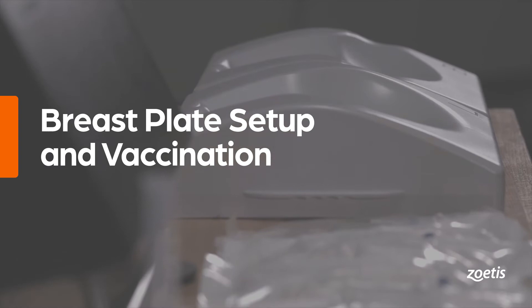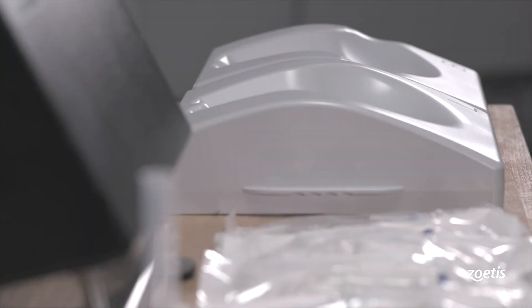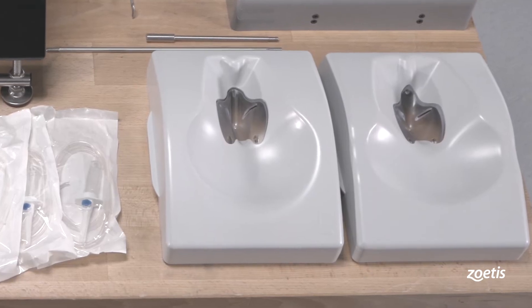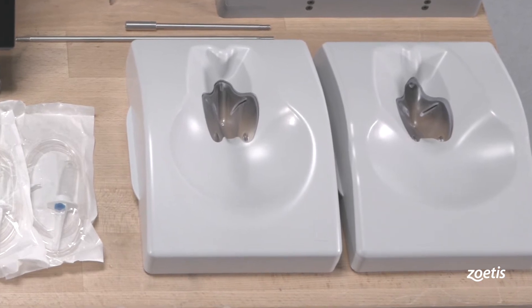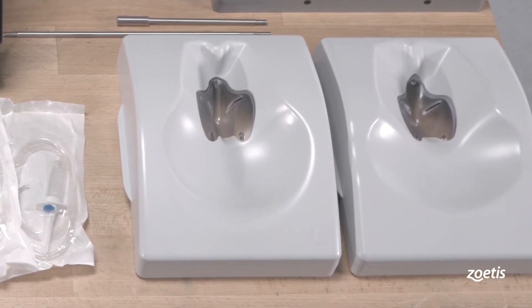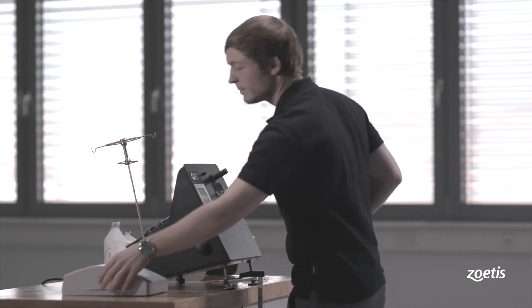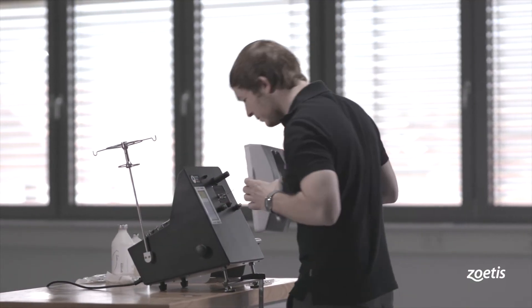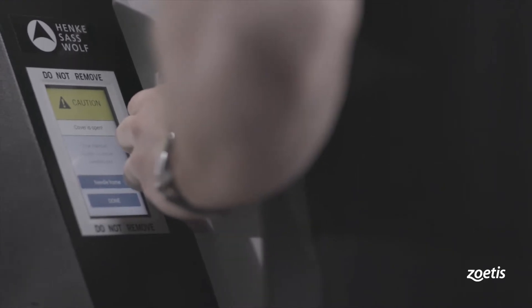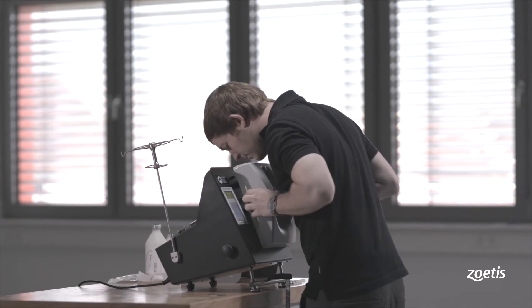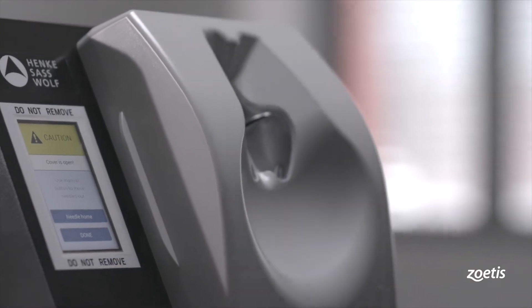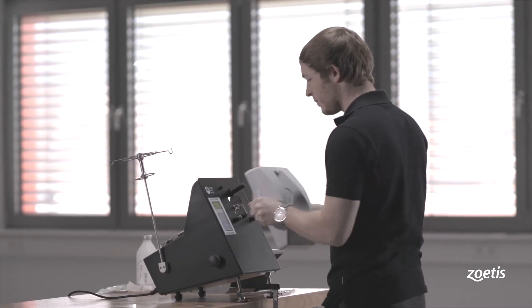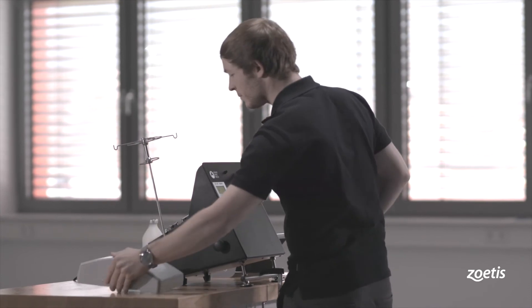The device can be used with different sizes of breastplates. The plate for layers is indicated with an L, and one for broiler breeders is indicated with a B on the plate. The breastplate is held in place using magnetic fixtures. To attach the plate, align the connections and place the breastplates on the device. To separate the breastplate, hold it on the left and right-hand sides and pull it towards you.